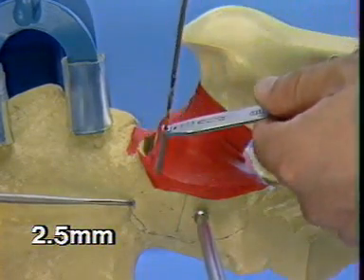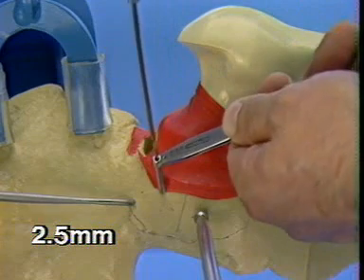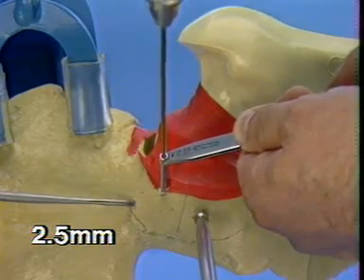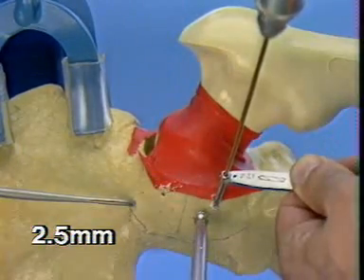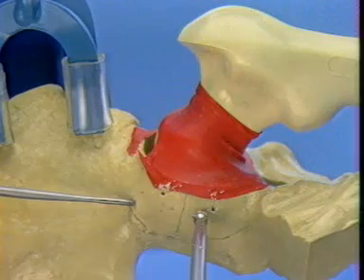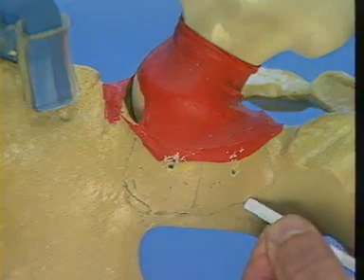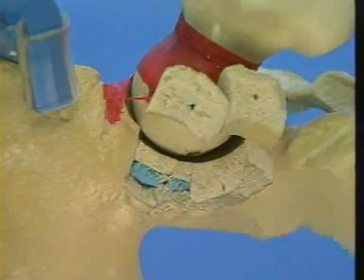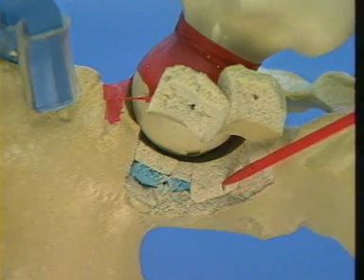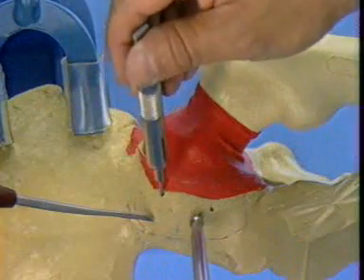With the patient in a lateral position, the 2.5 mm drill bit is directed vertically in order to avoid entering the joint. After drilling both holes, it's often advisable and quite instructive to redisplace the fragments of the posterior wall in order to make sure that the screws will be outside the joint. The depth of the holes is measured.